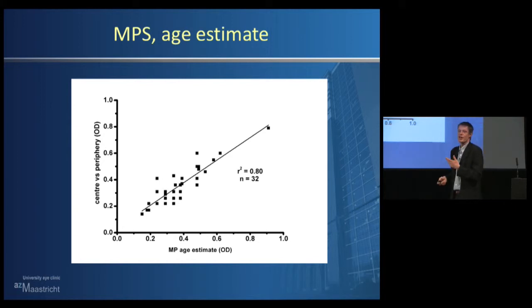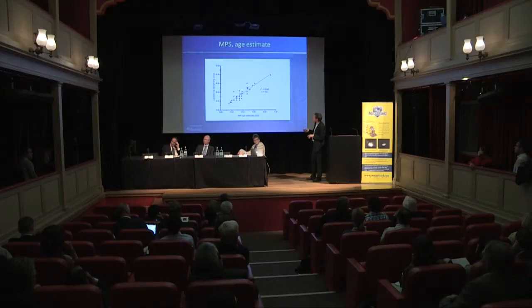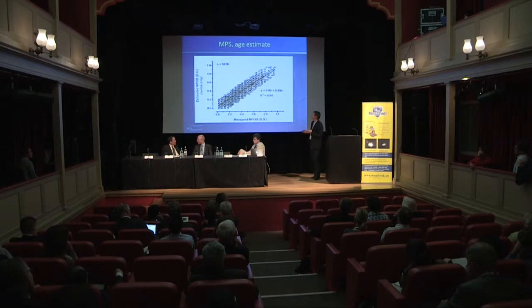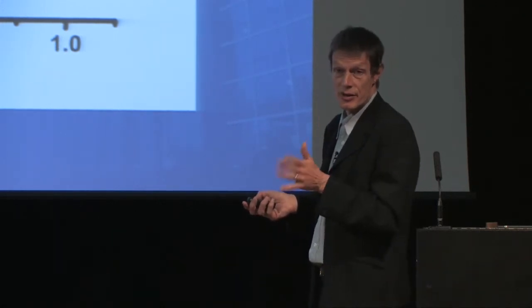This may be normal, not diabetes, not these particular subjects which you need. So you may question this. You can argue that if you want this test in a kind of intervention trial, then it's okay. But if you want to compare different subjects, then this may be arguable, as far as I'm concerned. These are results from one particular optometric practice, and these are results from a lot of subjects, and they correlate well. So, as I said, if you want to do it within an interval, I guess it's a good guess to use only the center measurement.